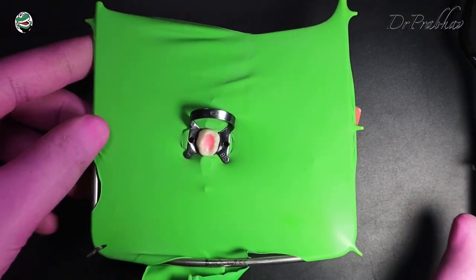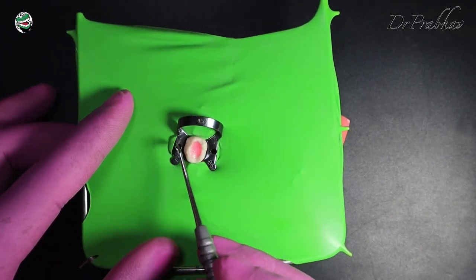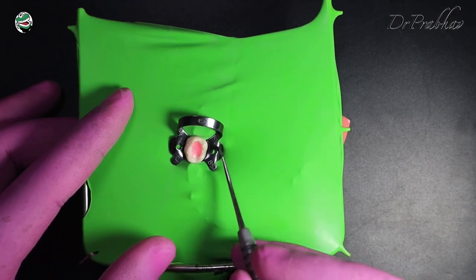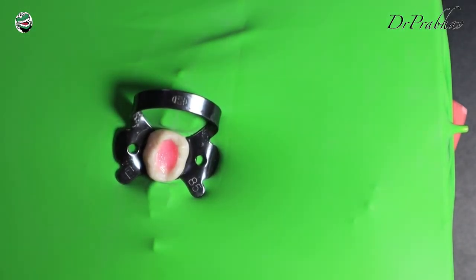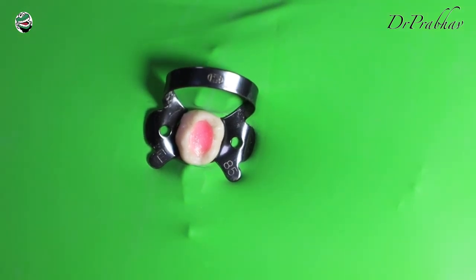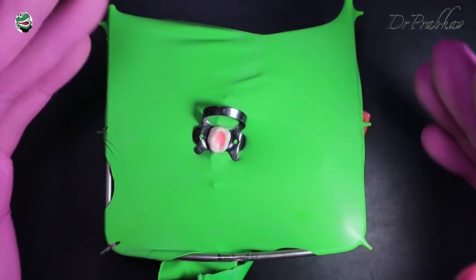So with the help of clamp holding forceps, we place it on the desired tooth, and finally with the help of a plastic filling instrument, we disengage the sheet from the wings of the clamp like this. So this is how it can be done easily. So let's see with the different colors and learn step by step.